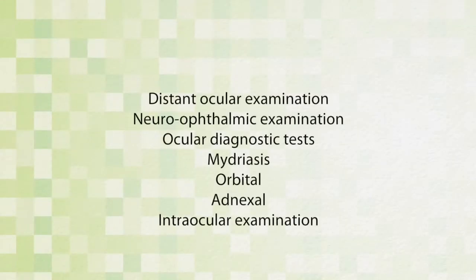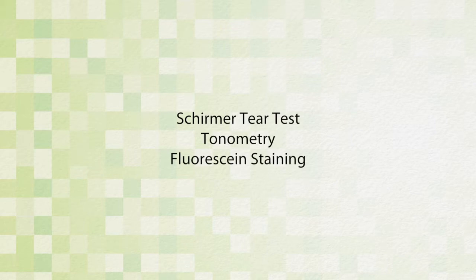The third component of the ocular examination is the diagnostic ocular tests. The ocular diagnostic tests that should be completed with every ocular examination are the Schirmer tear test, tonometry, and fluorescein staining.